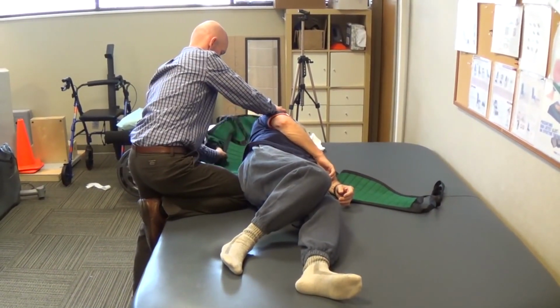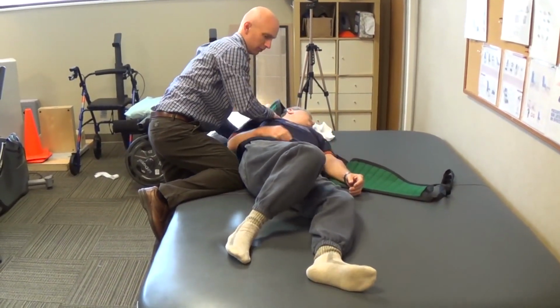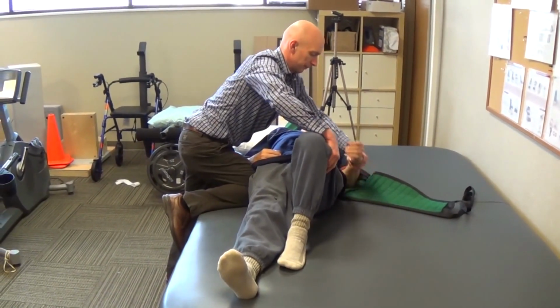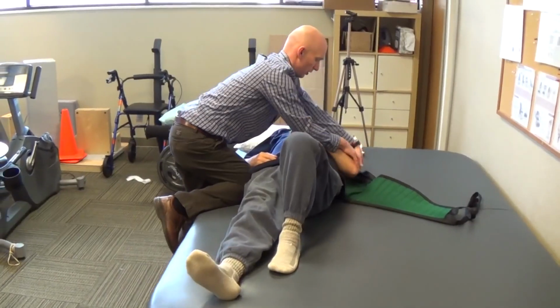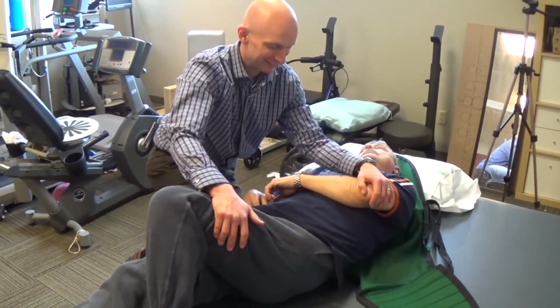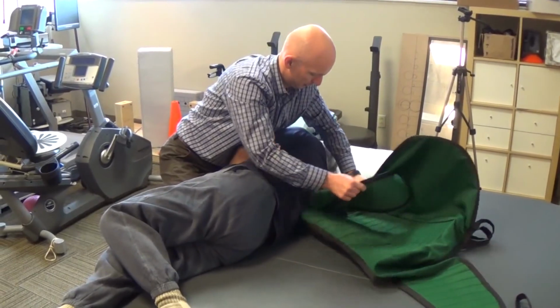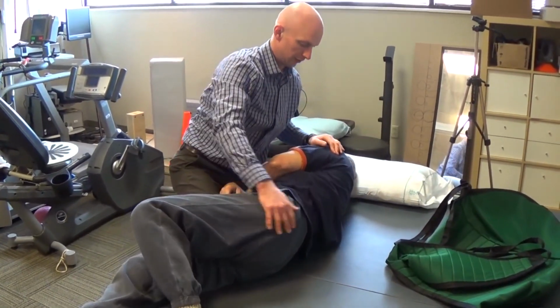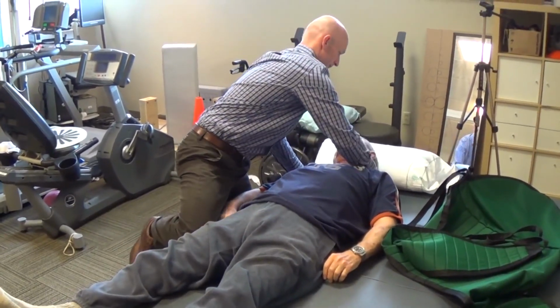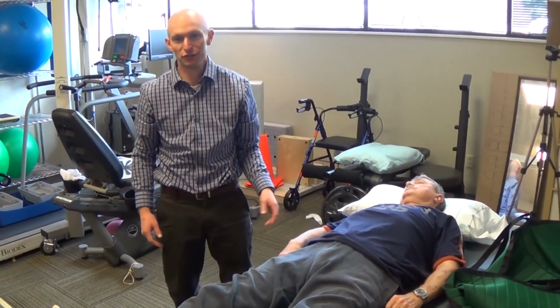Folding the sling up in half, and then assisting the person to roll back to the other side. Taking care not to pull on their arm, moving their head to the other side. And then pulling out the sling, and then assisting them to lay back to the middle of the bed. And that's how to use a hydraulic patient lifter to transfer a person to the bed.